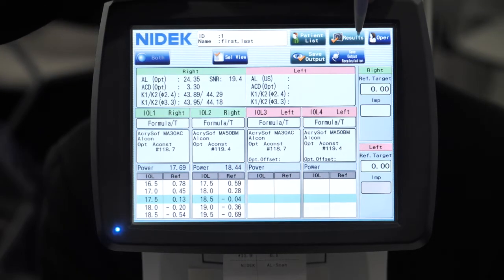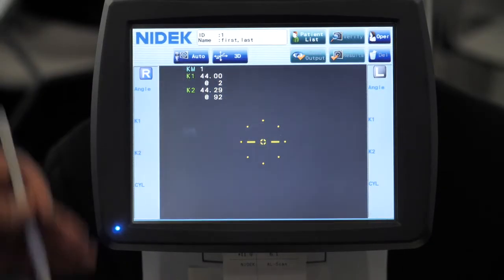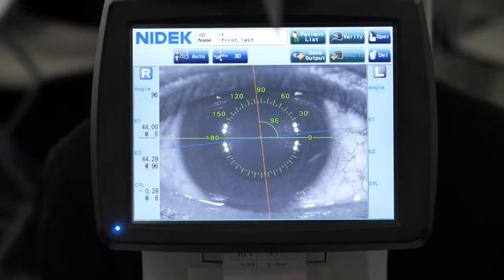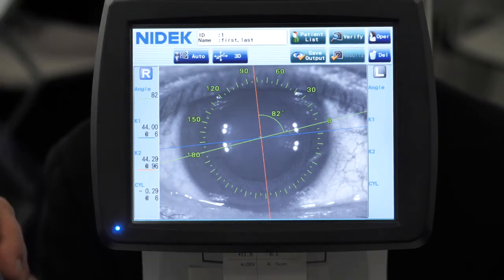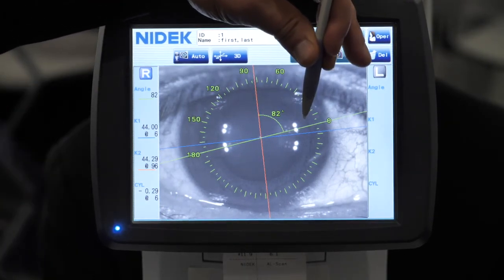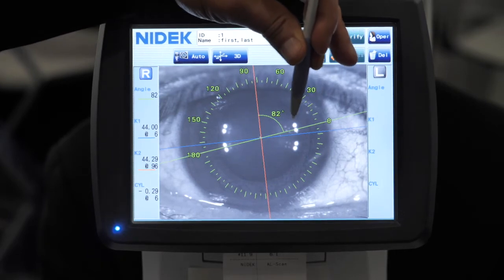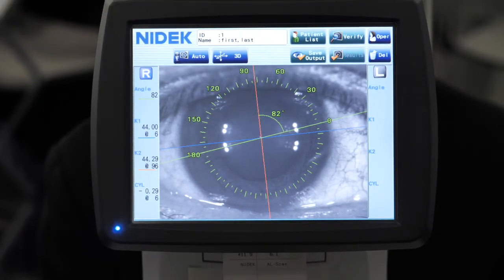The other nice feature that this device will give you is it has a toric assist function. So if I click on the toric assist, it's complete already. You can move this marker to an area on the patient's eye, say a bifurcation, and it's going to give you the degrees from that biomarker to the steep axis. As you can see here, it's 82 degrees. So the doctor can take this to the OR so they can properly place their toric IOLs.